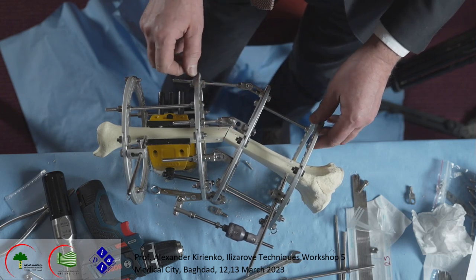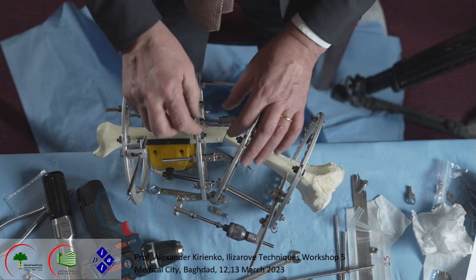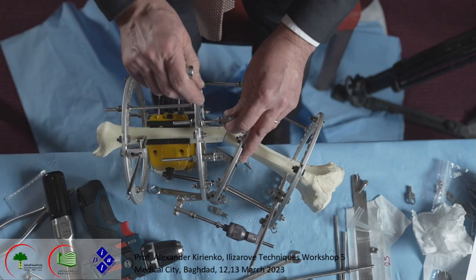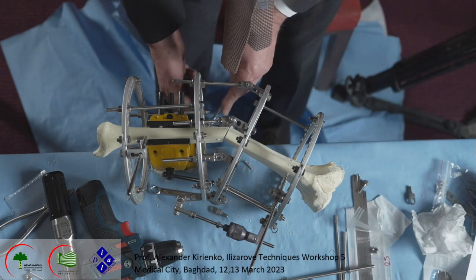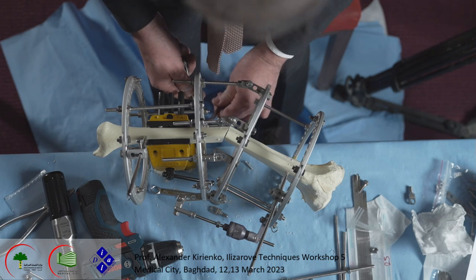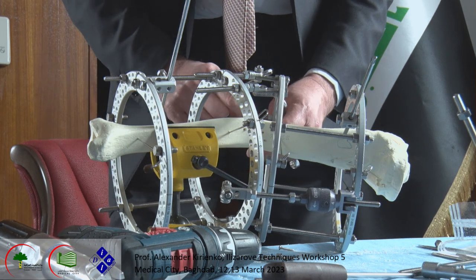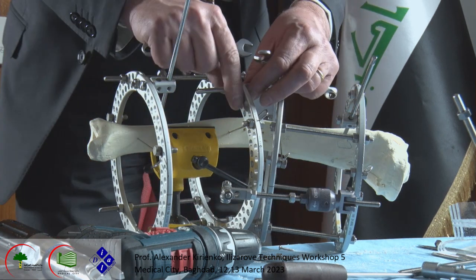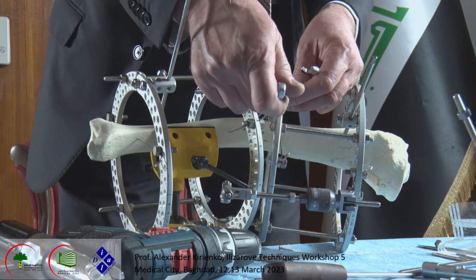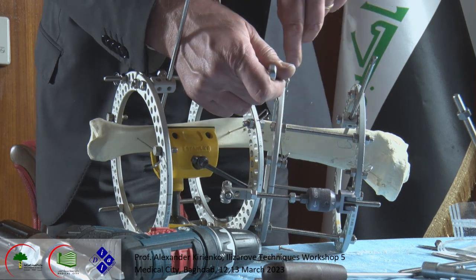Like I said before, before doing osteotomy, we disconnect the frame. We maintain the same position. Now we may tighten it a little bit, this posterior anterior rod. We release a little bit the hinges, all of them here. What I do, I release here because now I can't put it inside because it's so near, but I keep it ready for when it will be possible.